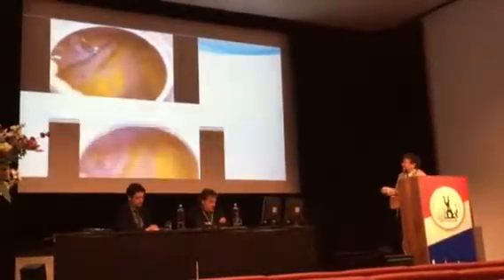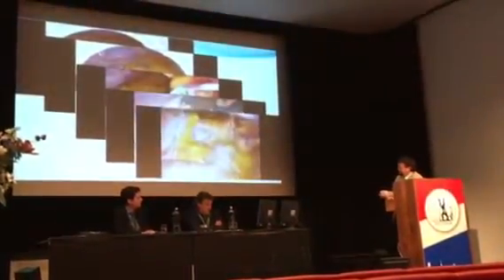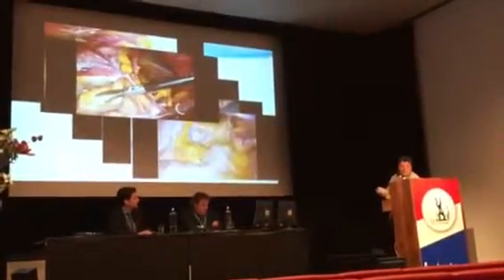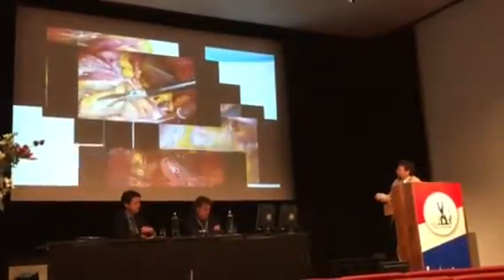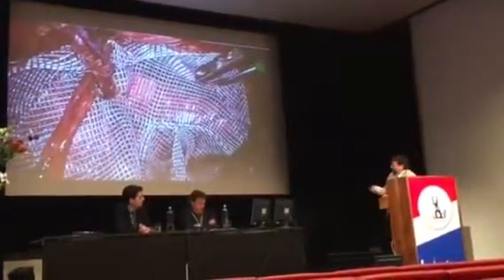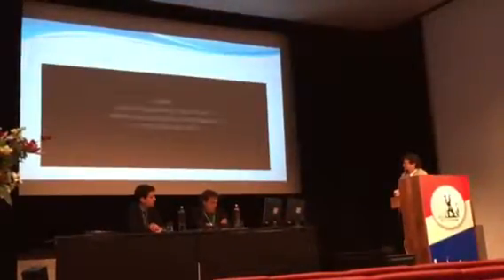So the point is that when you have this problem, you just have to turn your trocars to the intra-abdominal view, and now you can get access. You can reduce the large hernia, and then return to the TEP approach once again after changing from the intra-abdominal view, and perform your operative treatment. We have shown this procedure in 3 more examples.